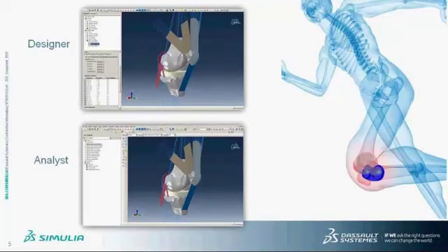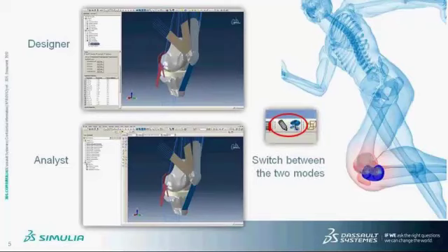The second mode is the analyst mode. This mode extends the functionalities of Abaqus Knee Simulator by providing all the tools and functionalities available in Abaqus CAE. Both modes build upon the same model database, which ensures a streamlined interchange of models between the designer and the analyst. Switching between the two modes is easy. It's done by a single mouse button click.